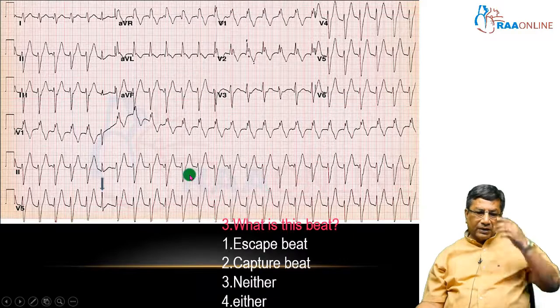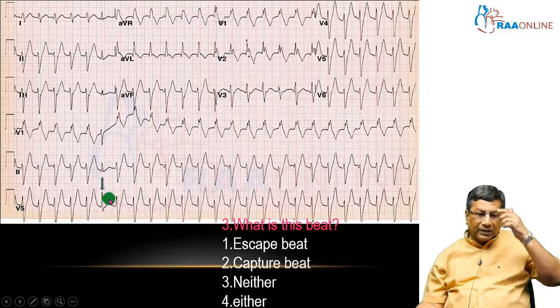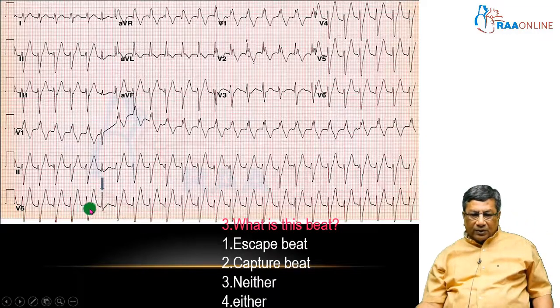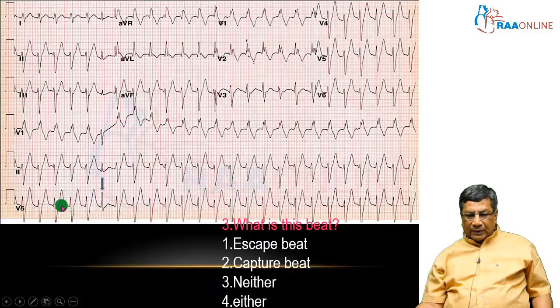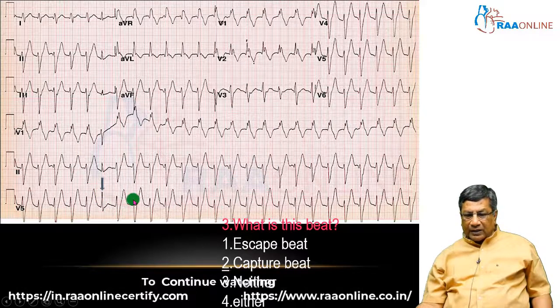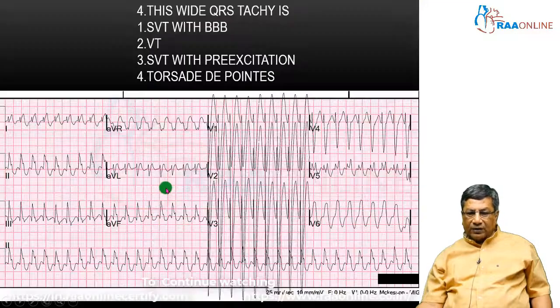Now we are asked to interpret the ECG and identify what a particular beat is. An arrow is shown pointing to a specific beat. The basic rhythm shows wide complex beats, and suddenly there is a narrow beat indicated by the arrow. In the presence of wide complex tachycardia, a sudden narrow beat is likely to be a capture beat, which indicates that this is likely to be ventricular tachycardia.